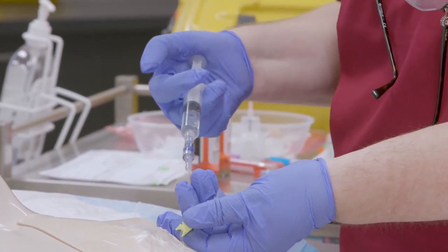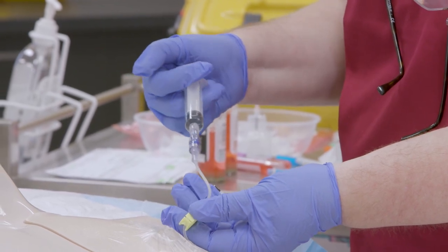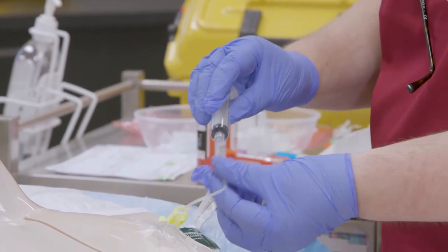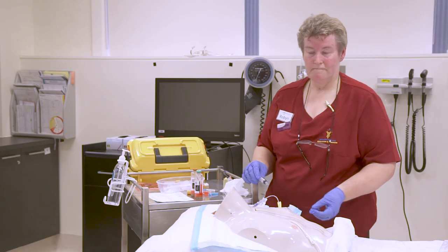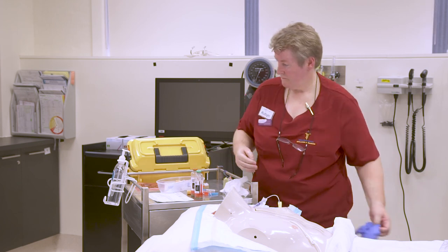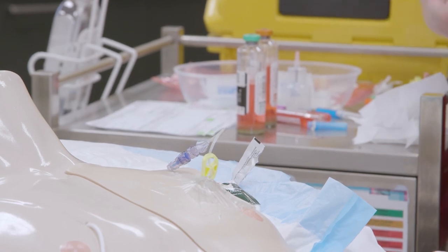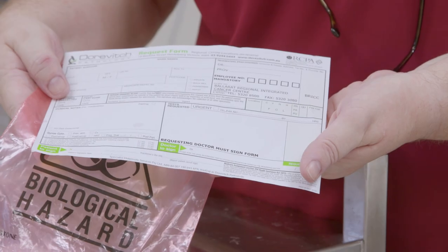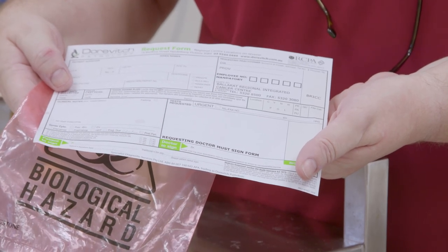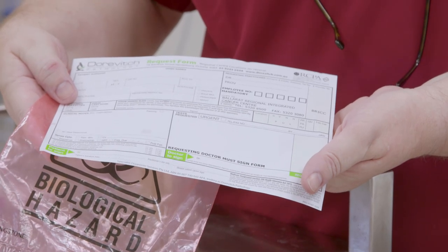Using your pulsatile technique, your stop-start motion, and once you get to half a mil, do your positive pressure clamping and you have now completed blood sampling. So once we've completed our blood sampling, of course, we need to complete our pathology slip, complete our pathology tubes at the bedside, and then send to pathology.